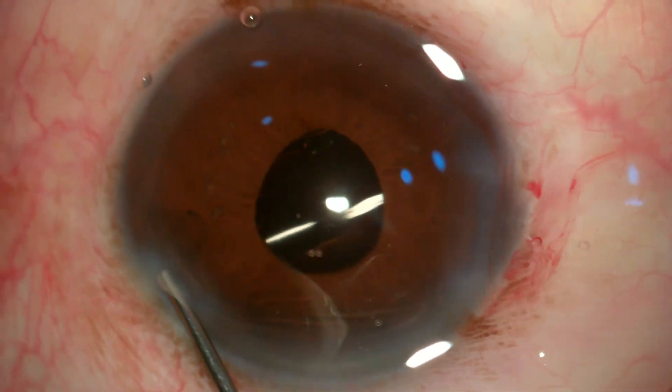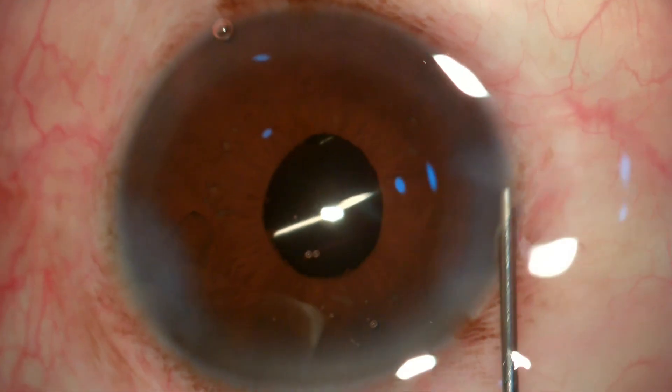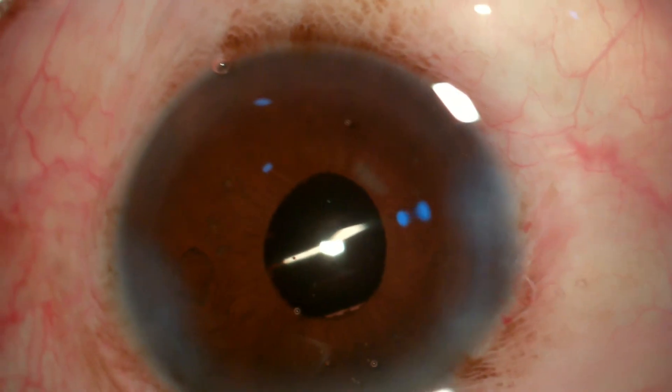I have not used any capsular hooks or rings in this patient — see the circular, round pupil. Thank you.